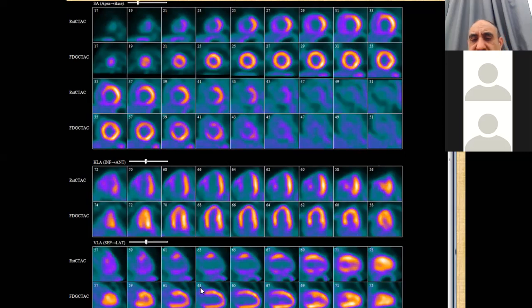The data for viability is old and dated. We don't actually have any new data about viability and revascularization on a large scale. The only published data was the STITCH trial, and the viability testing in the STITCH trial depended on thallium, not rubidium or fluorodeoxyglucose, and dobutamine stress echo.